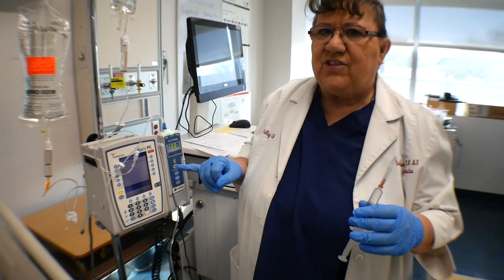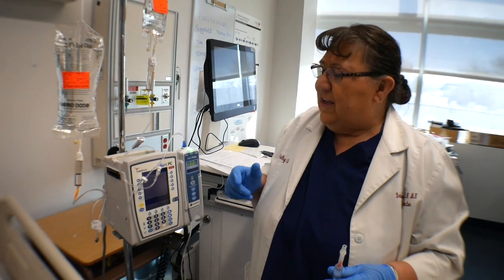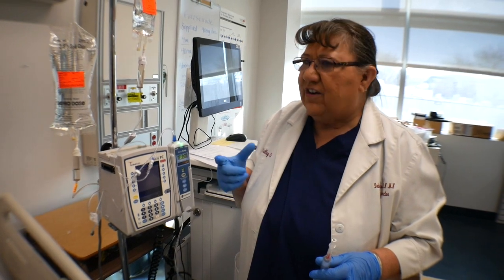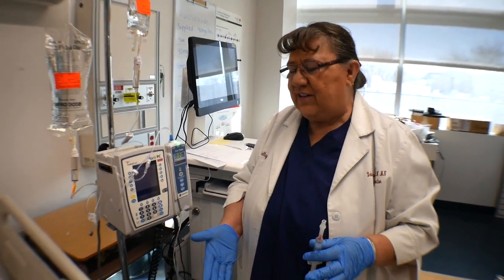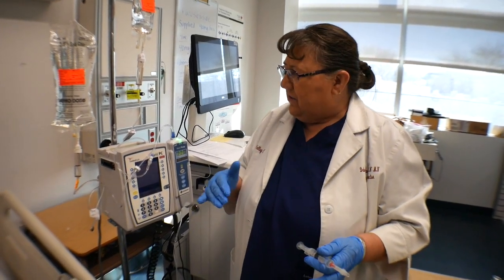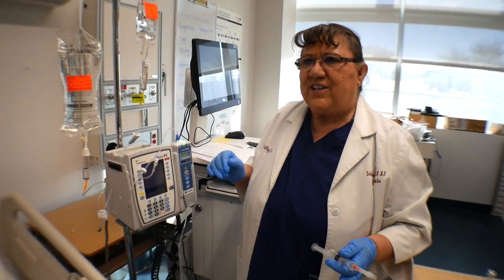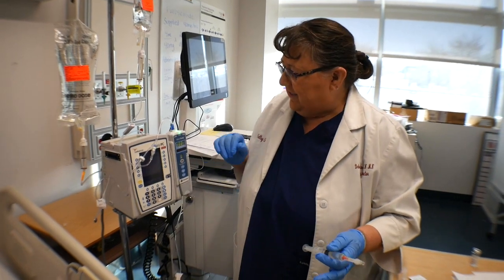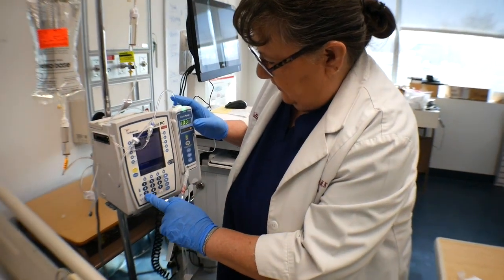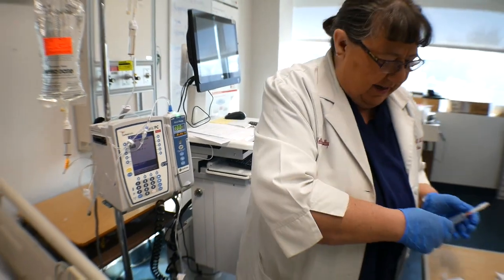The other thing that we want to look at is what rate it's running at. This one is running at 100. So when we're pushing, we're going to be clamping the tubing in between. If it's running at 100 and we clamp it for 10 or 15 seconds, it's going to beep because it's going to be running too fast. If it's running too slow, it's not going to flush in between. So usually we want to put it on 75 milliliters per hour. So in this case, we're going to change it to 75, and then restart it. And then I'll change my gloves.